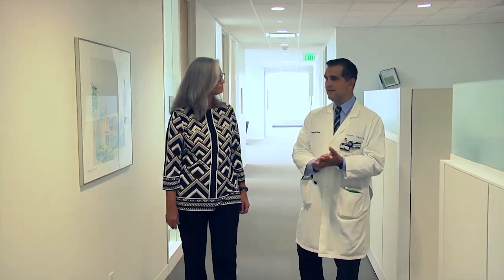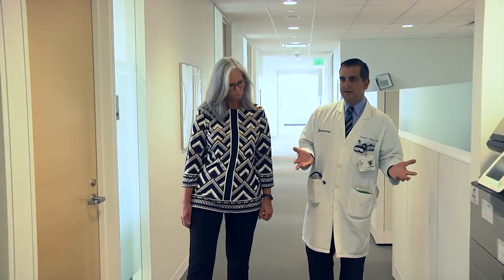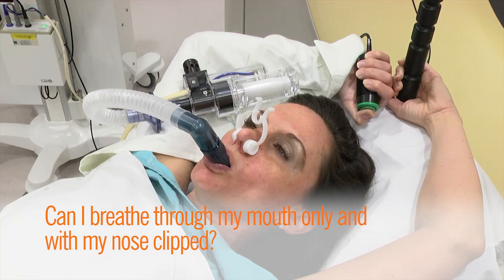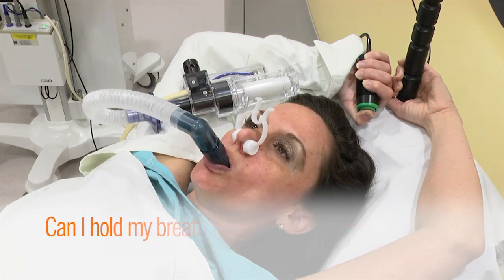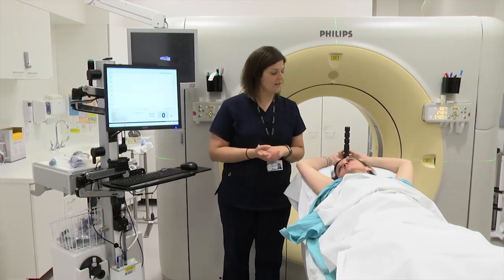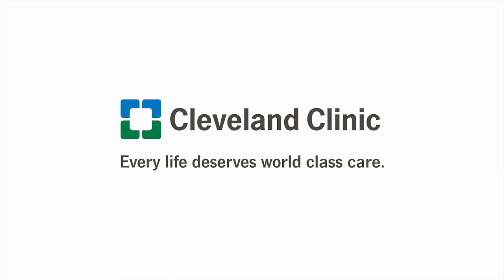Here are some questions you can ask yourself to see if you are a good candidate for using ABC for breath hold treatment. Can I breathe through my mouth only and with my nose clipped? Can I hold my breath for at least 20 seconds? If you have any questions, please ask your therapists. Thank you for choosing Cleveland Clinic for your care.